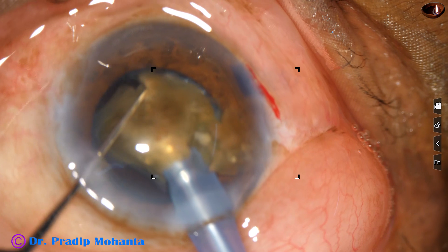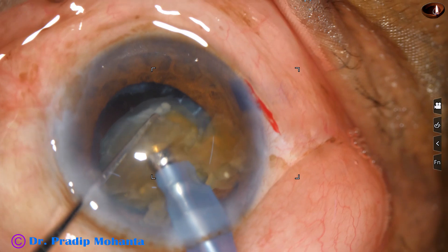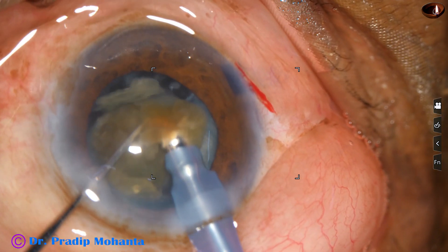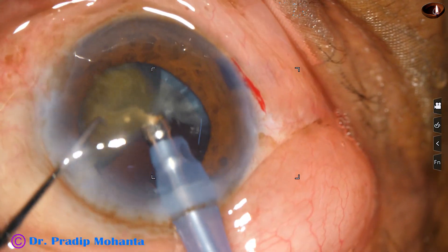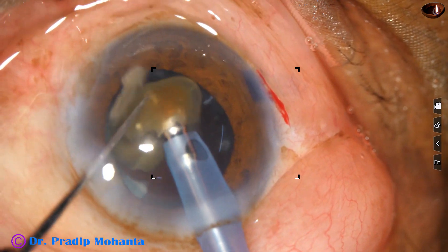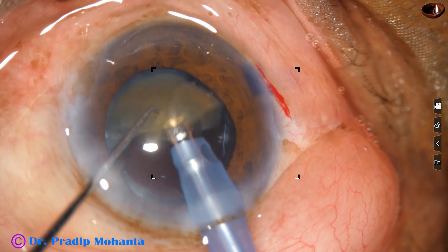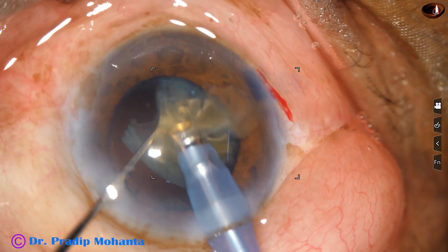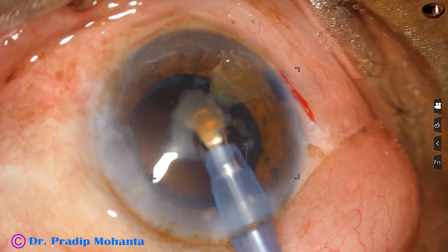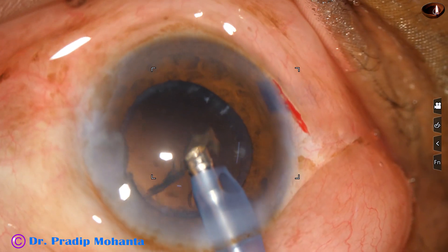Ultrasonic energy used in this case is 80%, flow rate is 40%, and vacuum is 400 mmHg. And during emulsification of the last piece, the parameters are reduced a bit, and it is done.